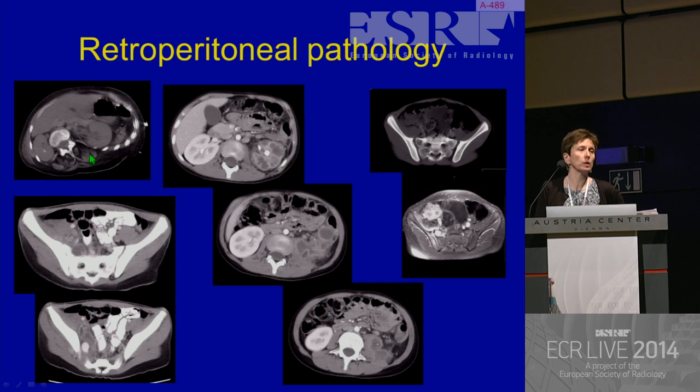This I could have put in the abnormal body habitus category. We all meet children who have bad neurodisability and they have a distorted body habitus due to that. And finding their abdominal organs is often very difficult, however long and hard you try, because the normal anatomic landmarks are just not there. And in this child, we'd certainly had a go with ultrasound first. We could see his kidneys, but we just weren't getting very good views of them. And we couldn't exclude the cause for his abdominal pain.